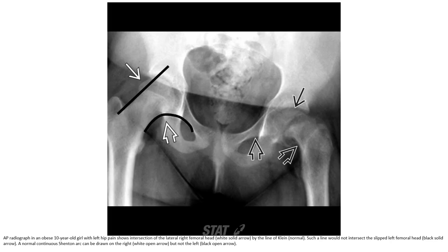This is the AP radiograph of a 10-year-old patient with left hip pain. On the right side, the line of Klein — drawn along the lateral femoral neck — normally intersects the femoral head, which is normal here. On the left, the line of Klein would not intersect the slipped femoral head. A normal continuous arc can be drawn on the right but not the left.